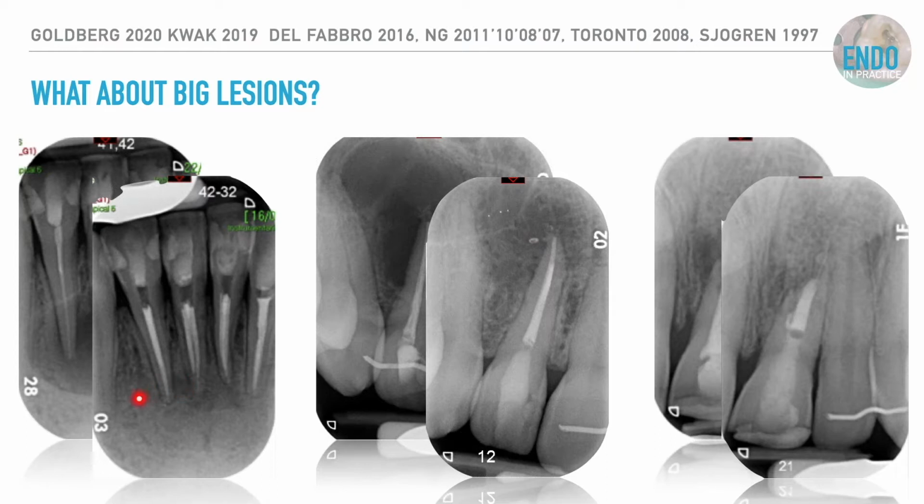Likewise, and I don't know how, but this one healed very, very quickly, to the point that when I reviewed the patient, they were just about to have internal and external bleaching, and the original referrer had popped out some of my original coronal seal to put bleach in these teeth, so that's why they look like that. But you can quite clearly see the lesion has healed up nicely. And even with some types of root resorption historically, we do have additional materials that can help the biological aspects of healing, recreating the cementum over the end, and potentially periodontal ligament over the end of the root.